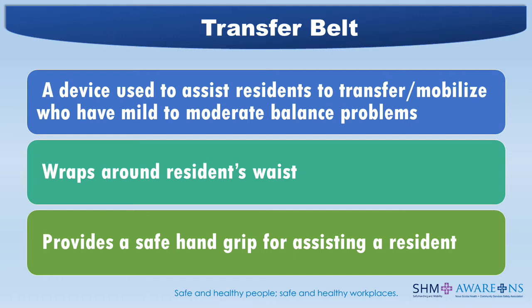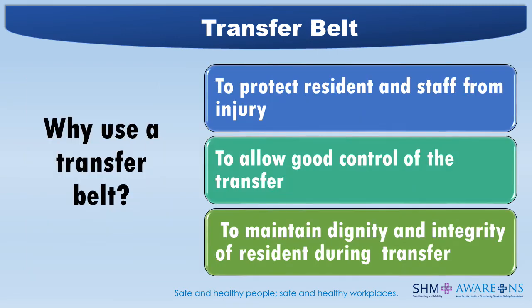A transfer belt is a device used to assist residents to transfer or mobilize those who have mild to moderate balance problems. The transfer belt wraps around a resident's waist and provides staff with a safe handgrip for assisting a resident. It's important to remember the belt is not intended to be a lifting tool. If you see the belt is riding up in the back, adjust it to fit snugly, and if this continues, a reassessment is required as you may be lifting. Use a transfer belt to protect the resident and staff from injury, to allow good control of the transfer, and to maintain dignity and integrity of the resident during the transfer.